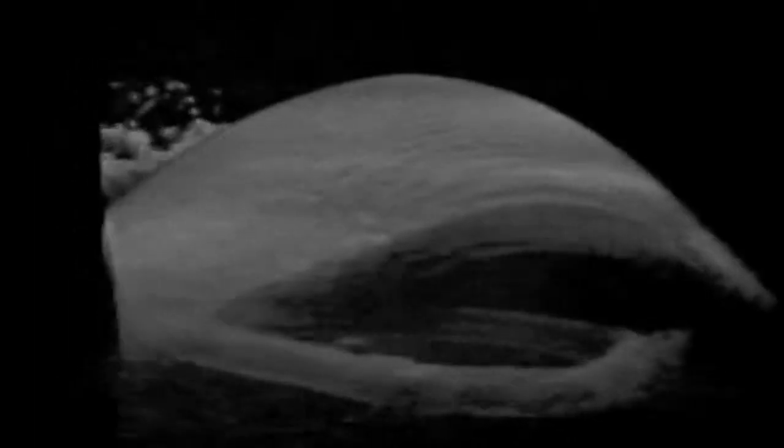The image processing tools include denoising for enhancing the contrast, statistical thresholding for separating signal from background, and clustering to retrieve the cornea and iris volumes. In addition, the algorithm is able to classify the data by their intensity values, allowing us to separate the most significant parts of the cornea volumes, as it can be, for instance, the anterior or posterior part of the cornea and the intrastromal rings if they are present.